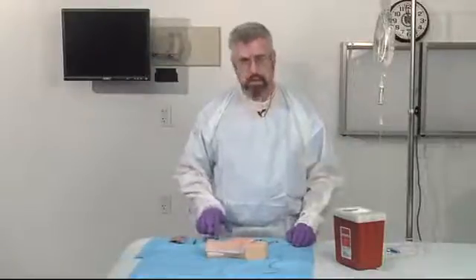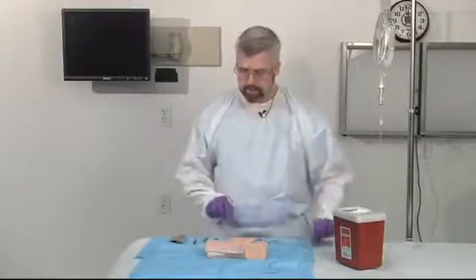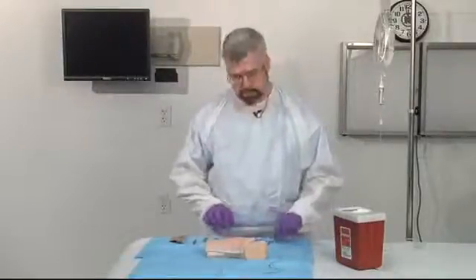There are several things that you want to make sure you have prior to doing a cut down. You want to make sure that you have the proper equipment. Things that you need at your disposal are a number 15 blade, a number 11 blade. You want an angiocath, or alternatively, you might actually use the end of an IV tubing to place within the vessel. You're going to need a pair of scissors, a couple of mosquito clamps, and some 2-0 silk.